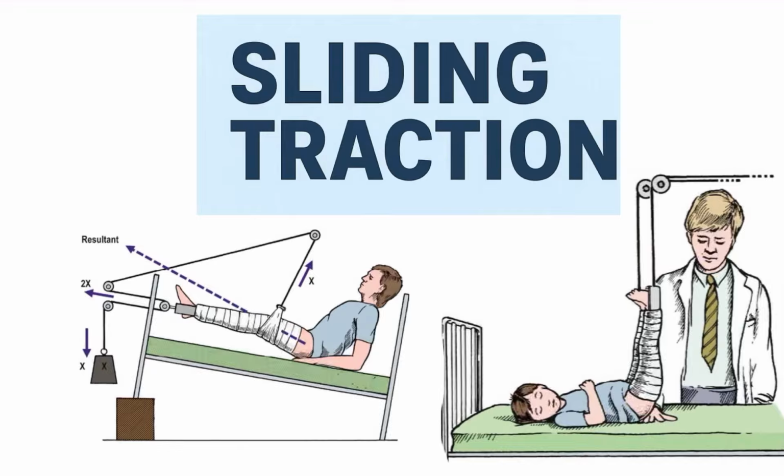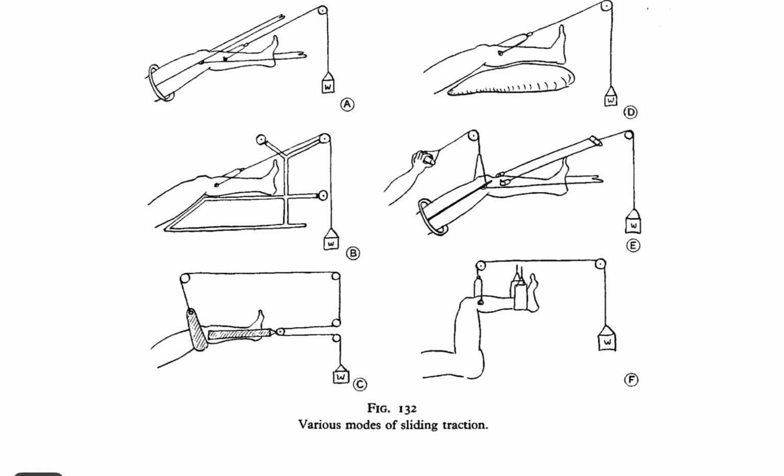Today we are going to discuss one of the most important topics from the practical examination point of view, that is sliding traction. Before going ahead, let's have a look at the various modes of sliding traction and try to identify each one of them.